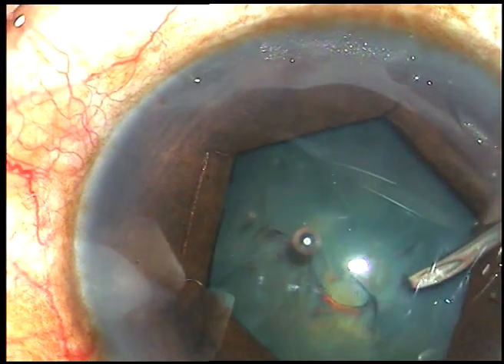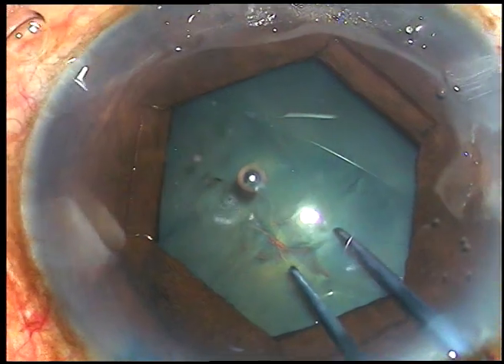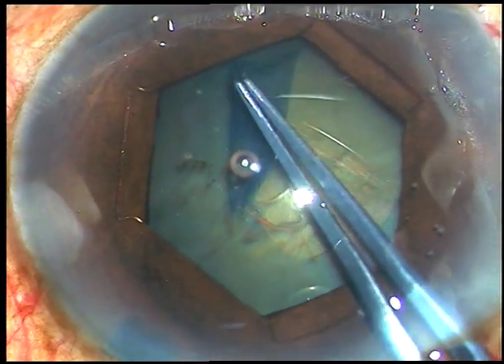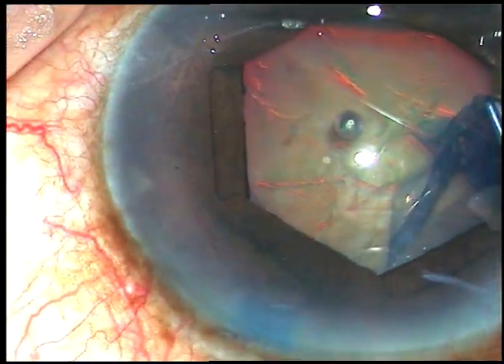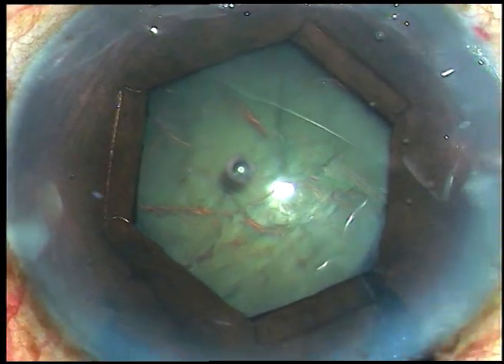Now I am doing capsulorhexis. The anterior capsulorhexis is incised. And now I take the utata forceps and, along the margin of these hexagonal pupil, I go all along and do this beautiful rhexis.